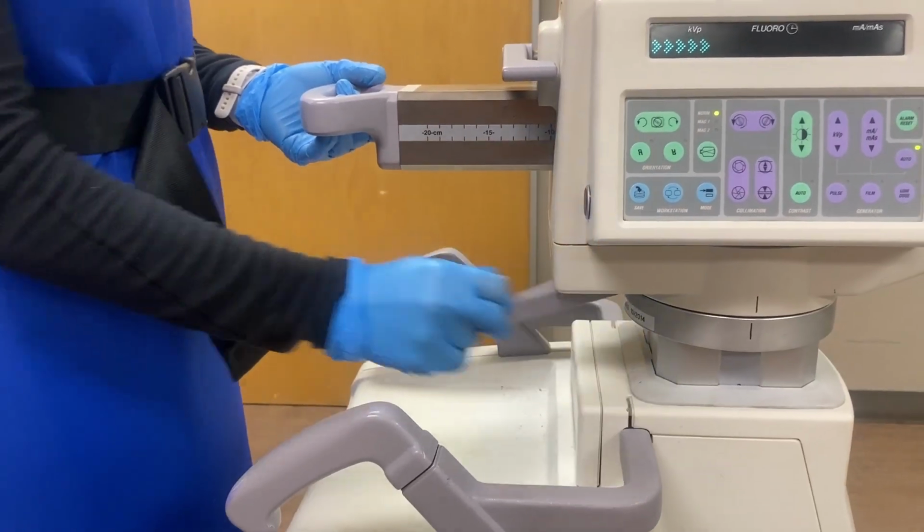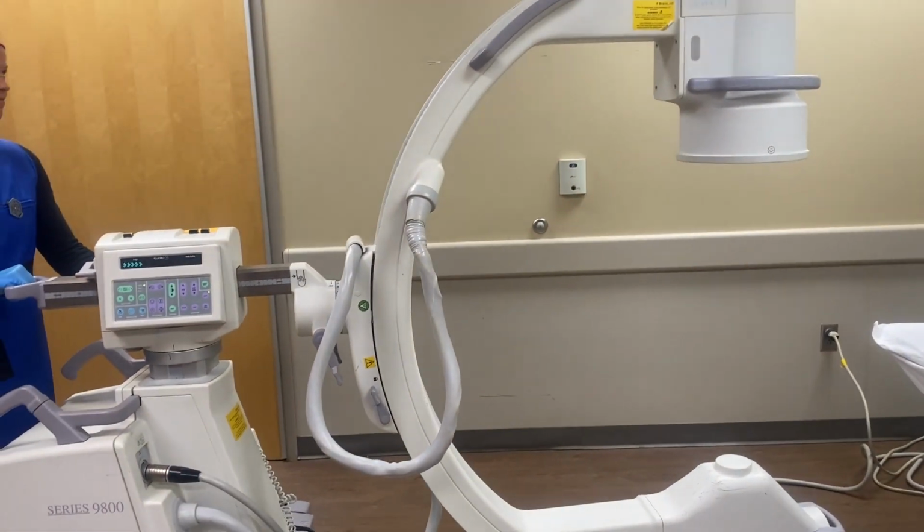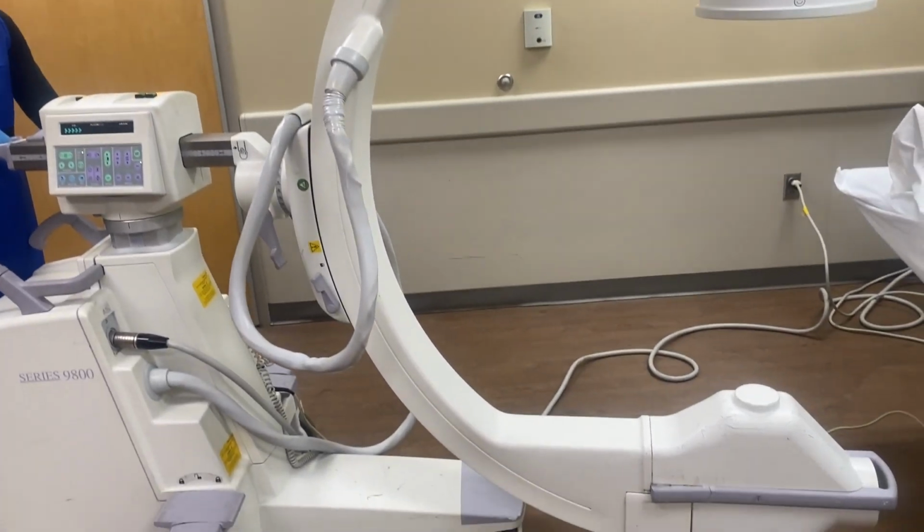The wig wag lock has a capability to move 5 degrees on both sides for a total of 10 degrees overall. It is able to move across the surface of the body.